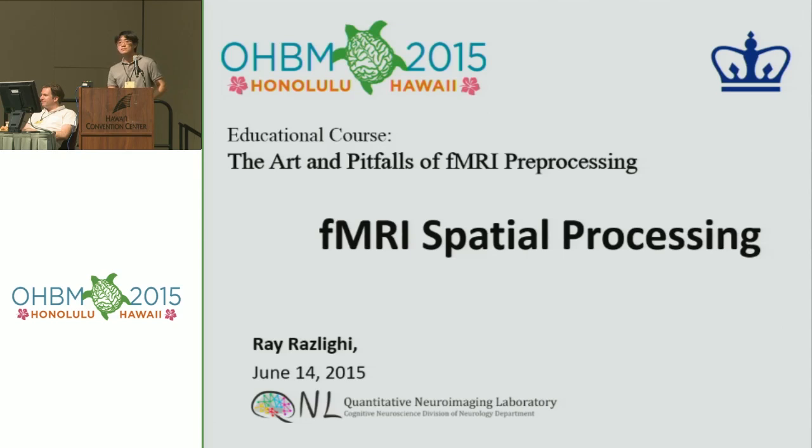What was the other question, sorry, you were asking? The second, the order. So the order, we don't know. It's as simple as this, because they interact with each other. I'll talk about it in my slides as well. Since they interact with each other, we have done many different simulations to see which one to do. None of them shows any significance over the other ones, because when the subject moves his head, at the same time the slices are acquired, and I'll show you in a slide how this mixes up the whole acquisition, and that's why we don't know a good way of doing it.